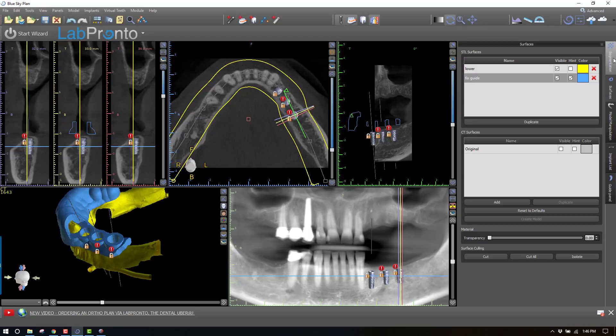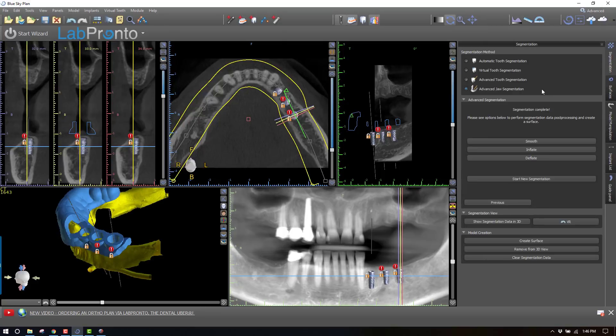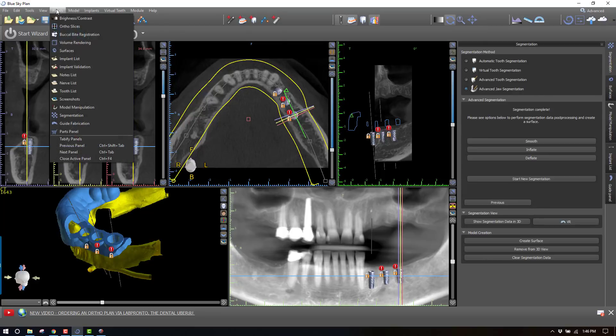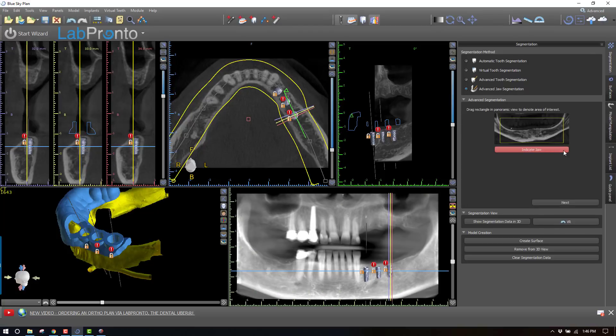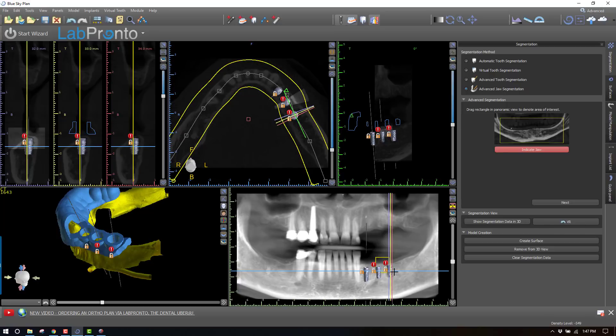The first thing we need to do is segment a portion of the bone. Segmentation can be done by going to Panels → Segmentation, and we want to choose Advanced Jaw Segmentation. The software leads you through a wizard. In this case, we don't need very much of the mandible at all — just a small section of bone that can serve as a stop. It's asking me to indicate which jaw I'm going to do, and I'm going to select an area from about the second implant back to just right here. Very small.